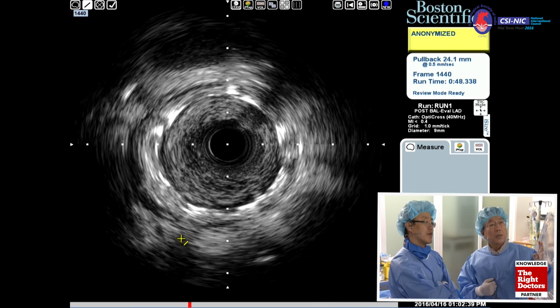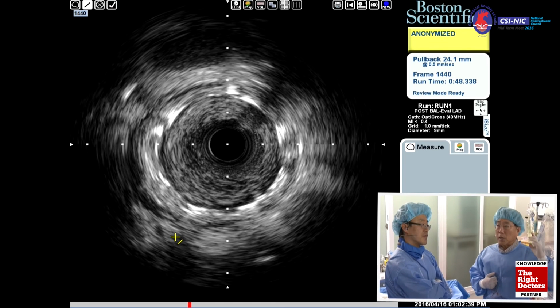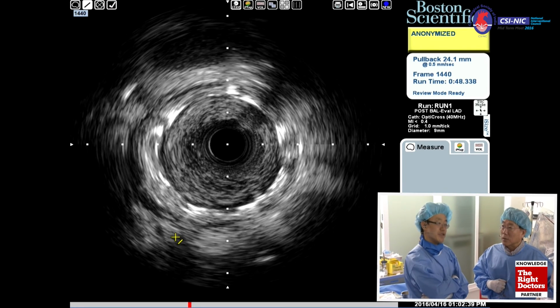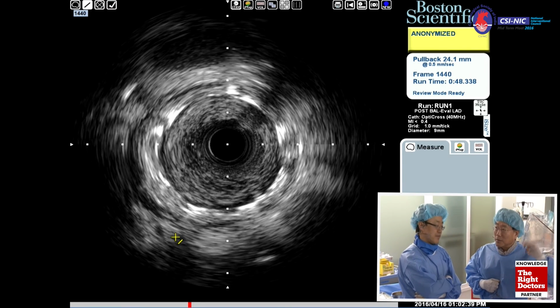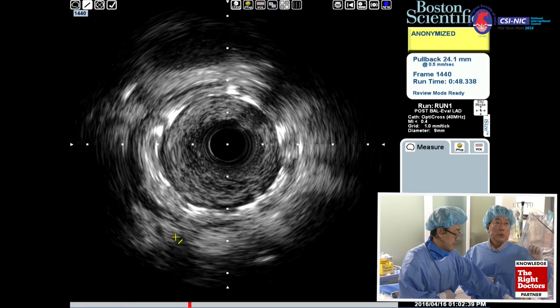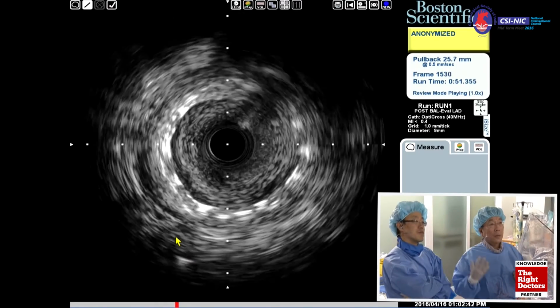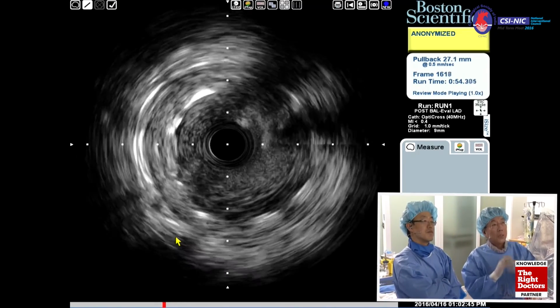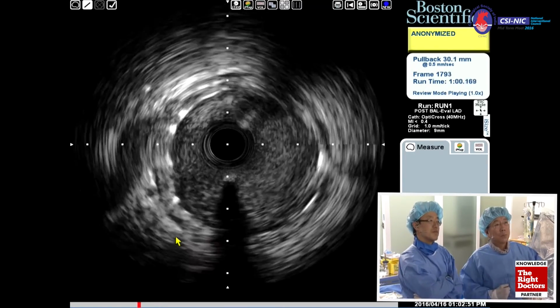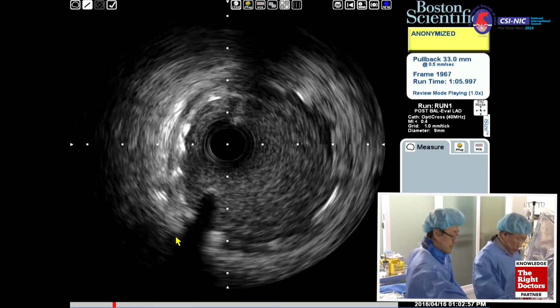Related ISR. If we have some ideas, OCT examination or VH-IVUS for this ISR lesion may be related to something. What do you think? Neoatherosclerosis, yes. Some vulnerable plaque characteristics inside. However, we have some limitations using grayscale IVUS for that. So we have mainly intima hyperplasia. We didn't get much information about the plaque characteristics itself. However, proximal part stent expansion is quite good.